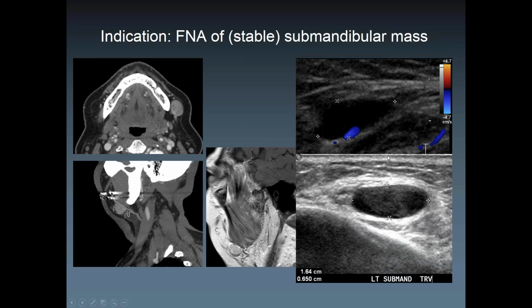And with B mode, which is officially the better grayscale quality, it looks like that. So it's not completely hypoechoic like a cyst or a fluid kind of thing you would be, but it could be because you're also dealing with reverb artifacts because you are dealing with a lesion in a near field, right? So it's about a centimeter distance from the skin.